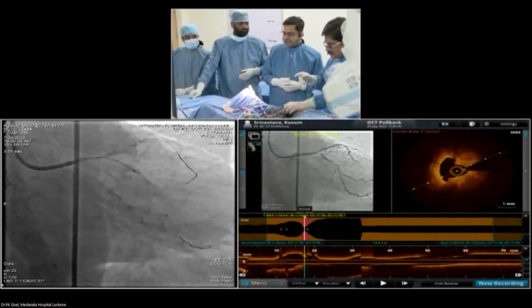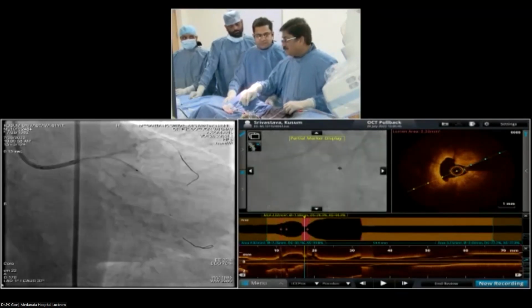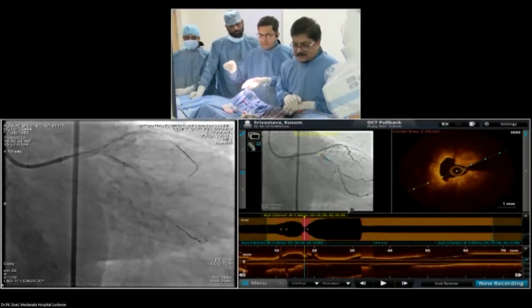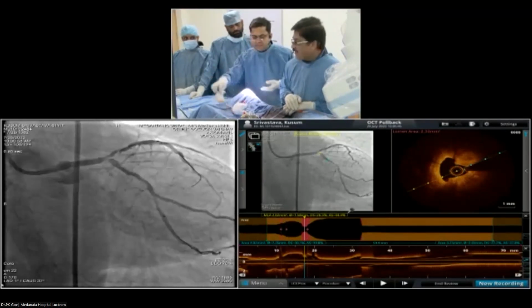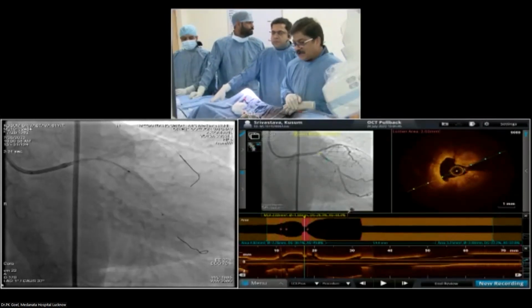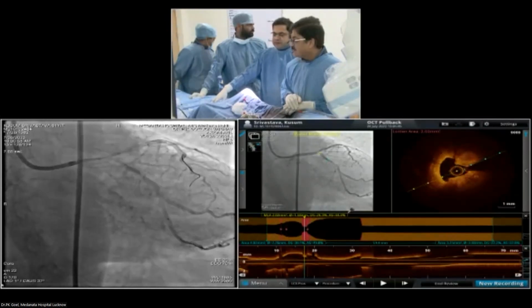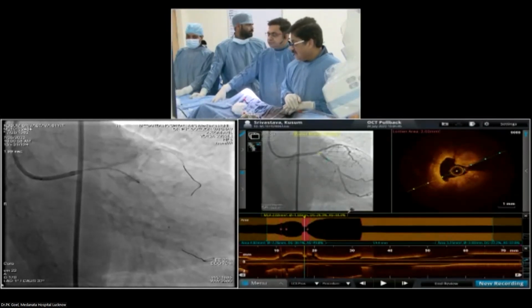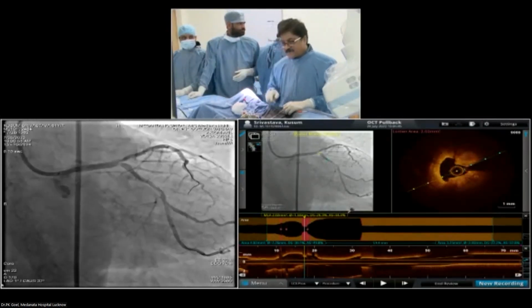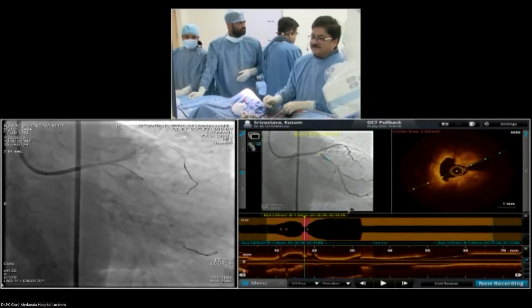Now this depends on how I think about it. I am not a very strong proponent for crossovers. Sometimes you pinch these circumflexes and then there's a problem to re-enter. At least for the left main bifurcation, if there is disease, I would prefer 2 stents. And it is calcific. You see, there's so much calcium there. By definition, it is less than 10 millimeters. Yes, and I also understand it is a very focal, low risk lesion. You can just go with the single stent.